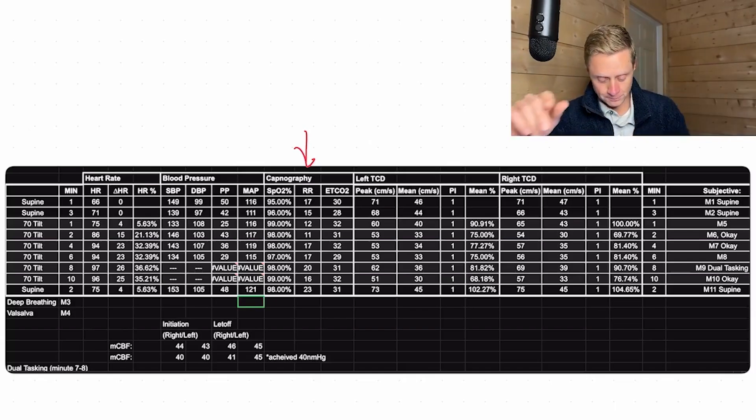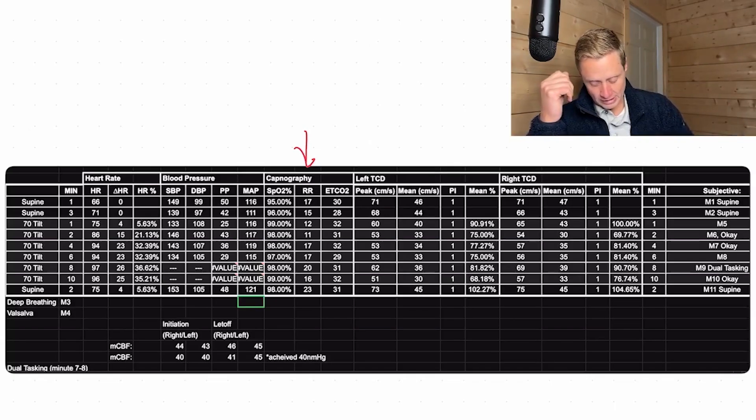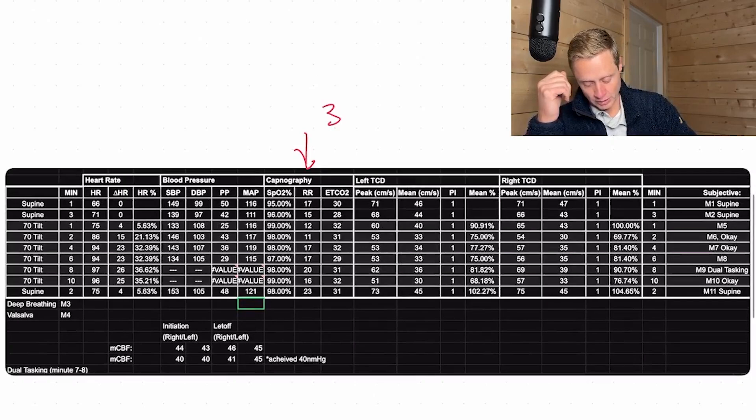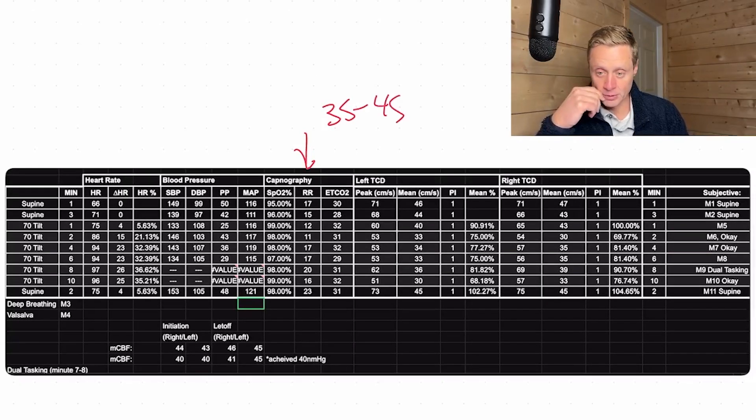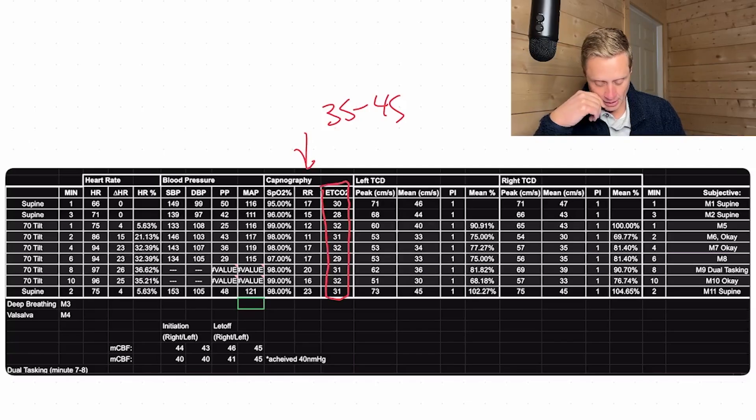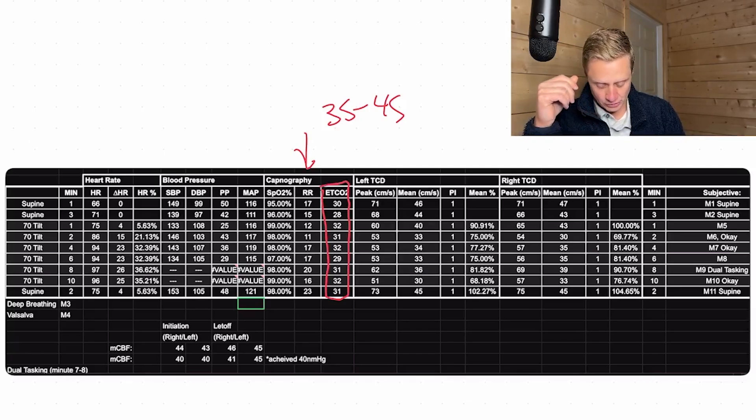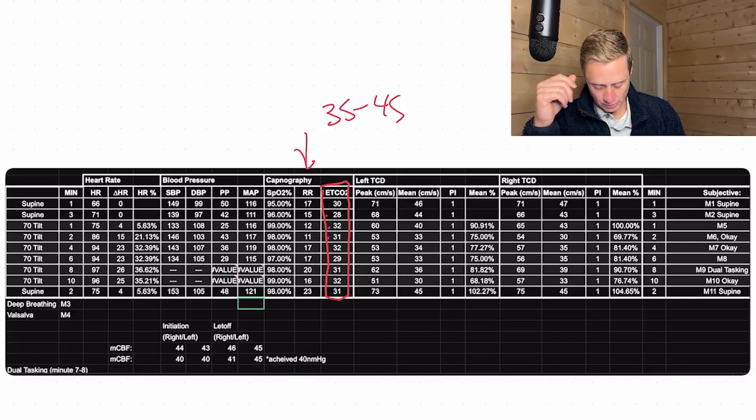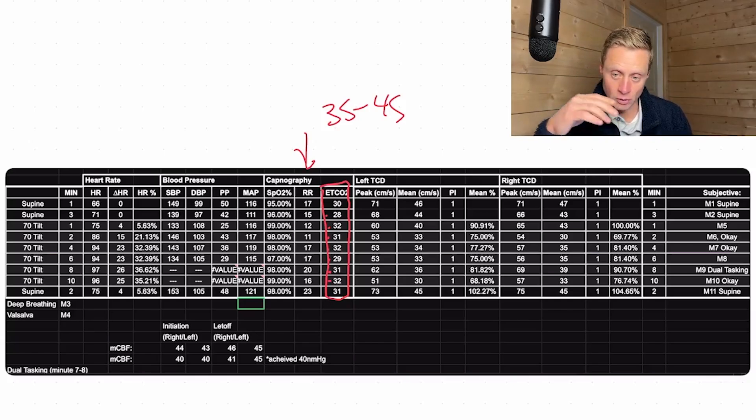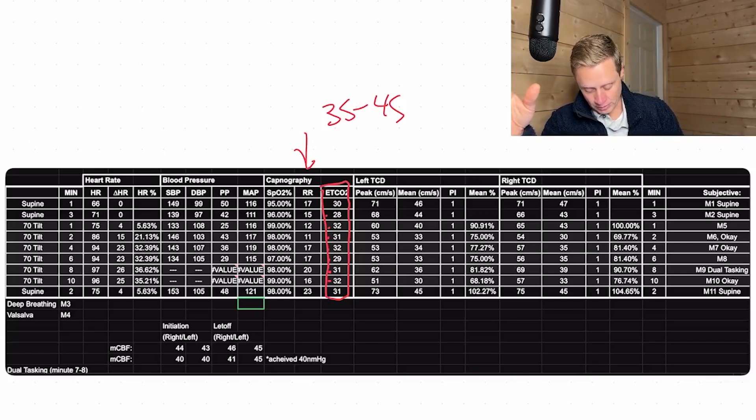So if we think about that, we want that CO2 number here to be between 35 and 45 millimeters of mercury. If you look down in this box here, we can see that even from a starting point, we're starting at about 30 millimeters of mercury and it's dropping. So that end-tidal CO2 number is dropping as low as 28, 32, 31, 32, 29, 31, 32. It stays relatively low throughout the tilt, and that's important.